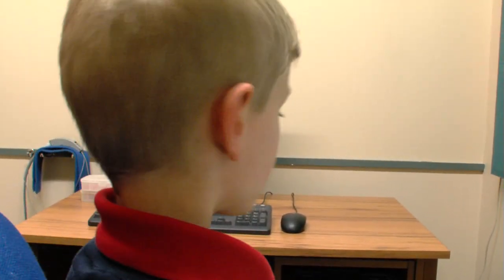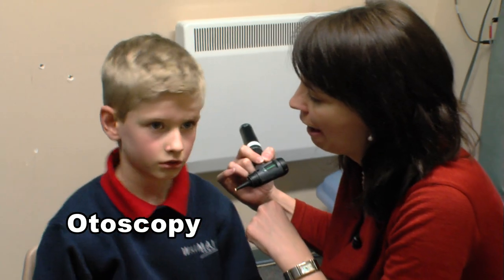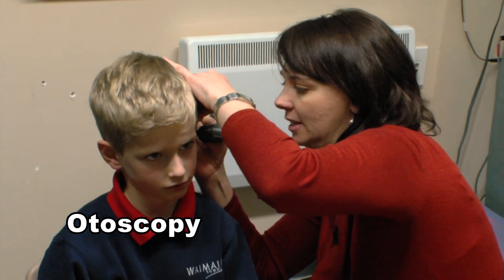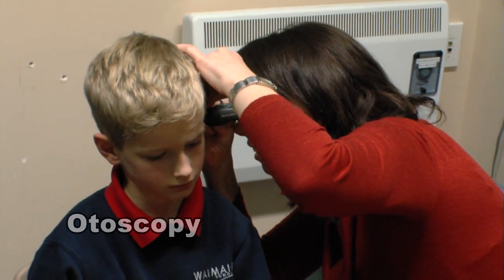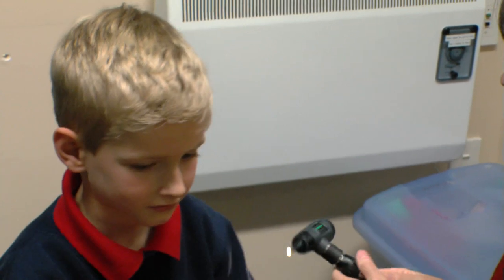Right, now we can go and test your ears. We're going to play a listening game, Angus. Right, Angus, let's have a wee look in your ear, see if I can see any dinosaurs in there. As for adult clients, otoscopy can reveal important information about possible pathologies in paediatric clients. Oh, that looks all good to go. We can play our listening game.